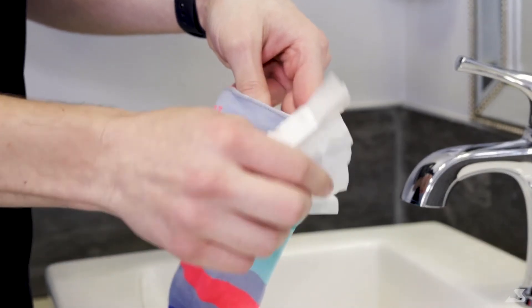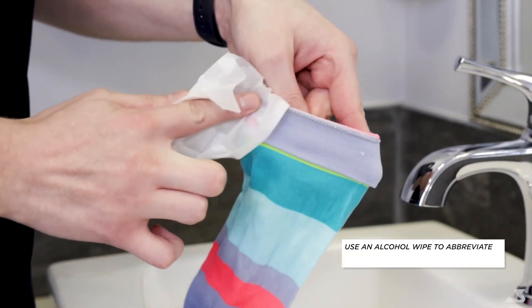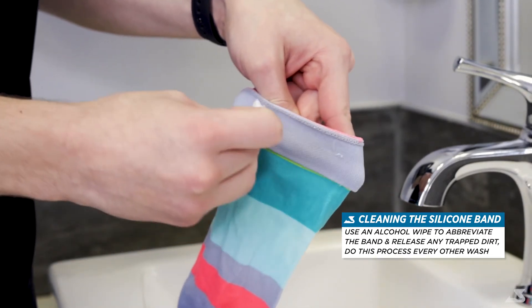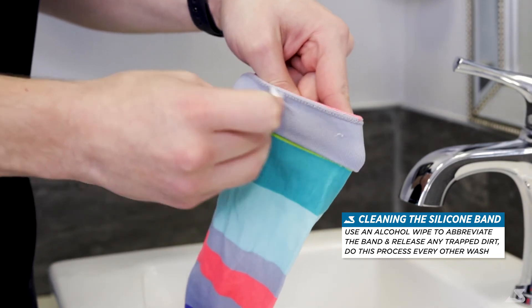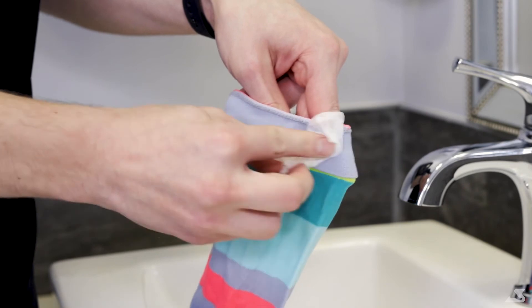Lastly, one important thing to note is that if your compression garments feature a silicone or rubber band on the inside of them, you'll also want to wash this part every so often. To effectively wash this and remove all the skin particles and debris, you will use an alcohol wipe and rub the silicone part in a circular motion.